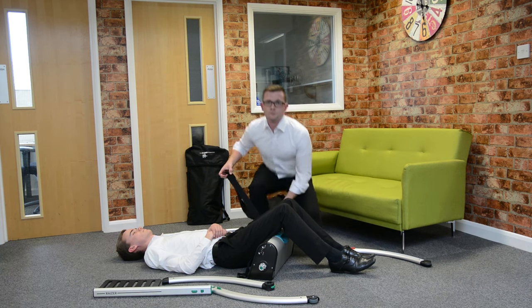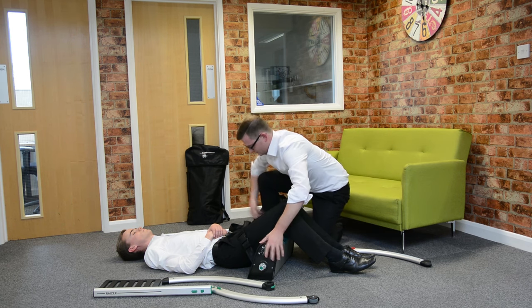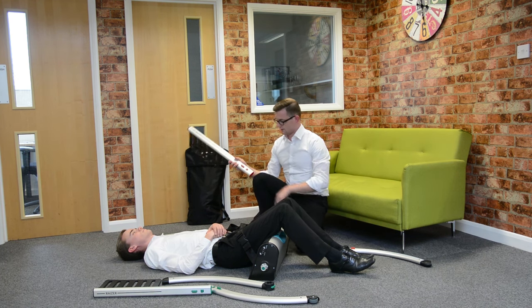We put the belt on, which is mainly for reassurance. Then there are three parts of each side that are colour coded, so green for this side, then red for this side.